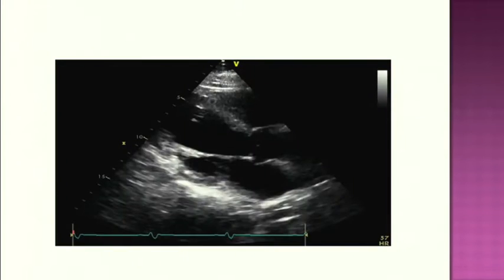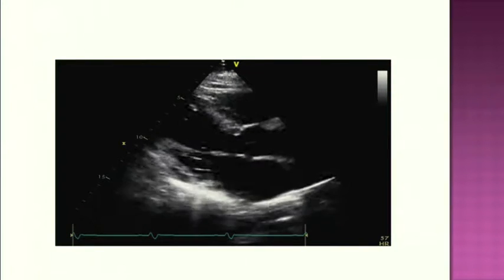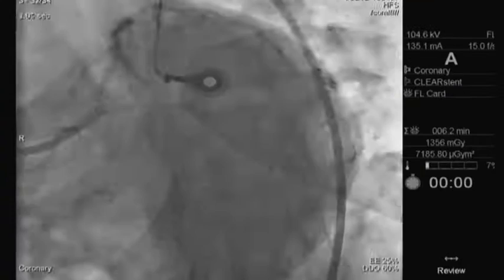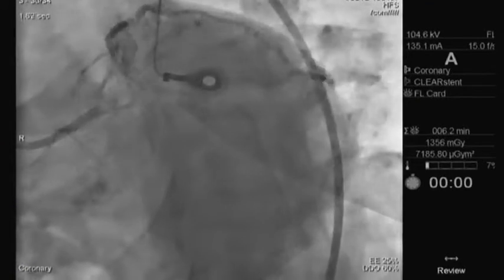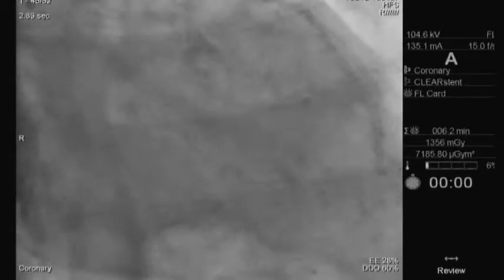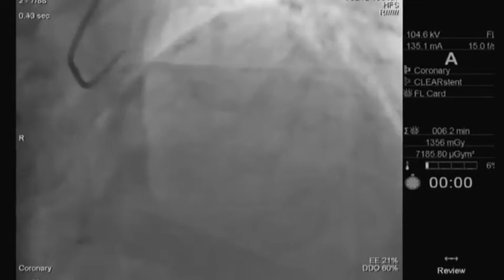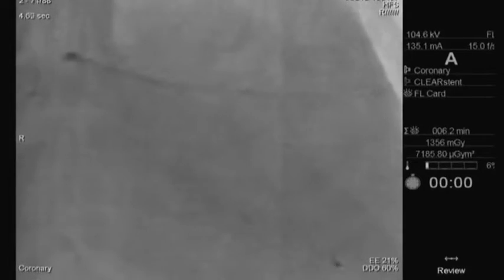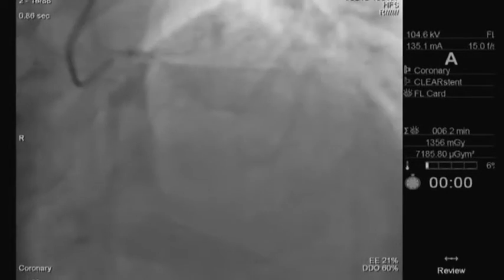So we'll straight away take you to the angiogram. So next, the angiogram, please. And we see this is the view in LAO caudal. So this is the angiogram. Yes, sir. So we have a lesion in the bifurcation of the LAD and diagonal. Both are significantly big branches. We have a big collateral towards the right.